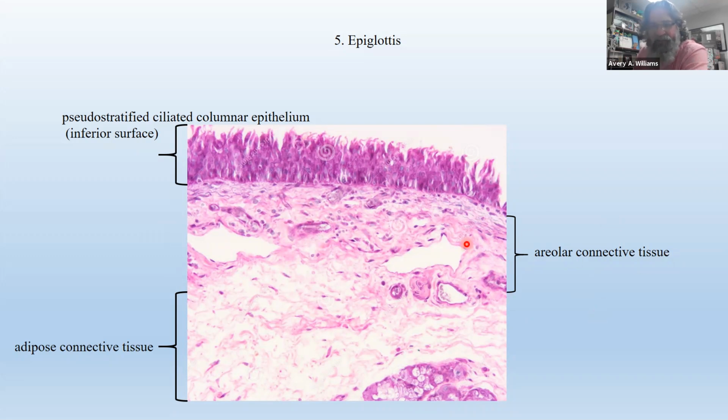This is areolar connective tissue. Remember I said areolar? It's kind of like a space filler. Remember we saw areolar in the papillary layer of the dermis, and it's kind of the same zone, same area.